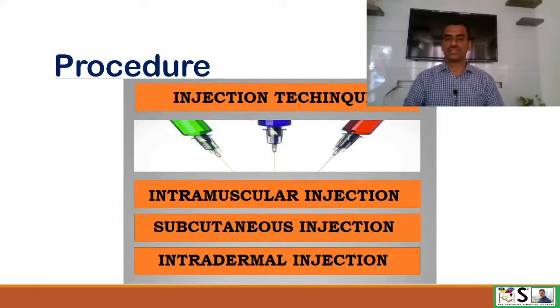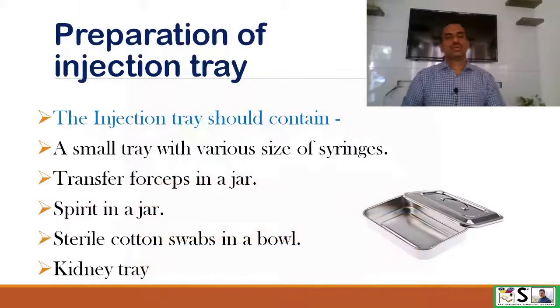Now we come to the procedure of injection techniques: intramuscular injection, subcutaneous injection and intradermal injection. Preparation of injection tray. Before starting any procedure, we need to make a tray.